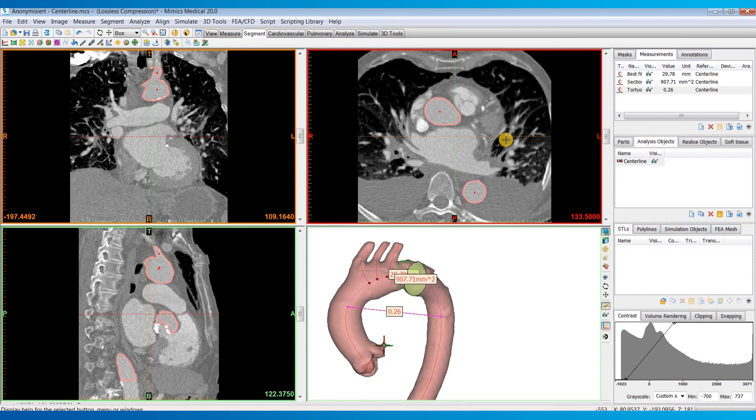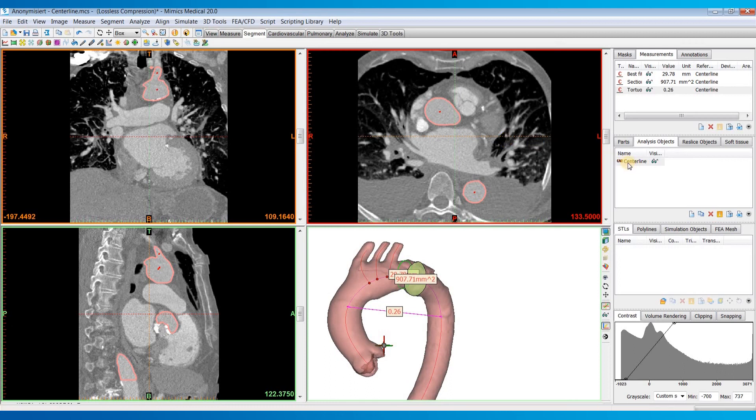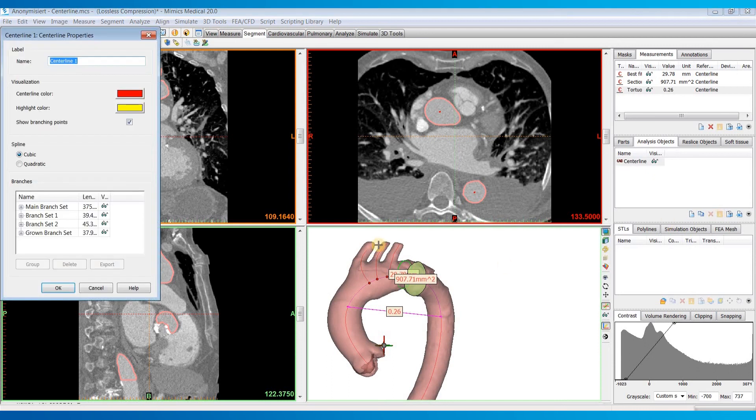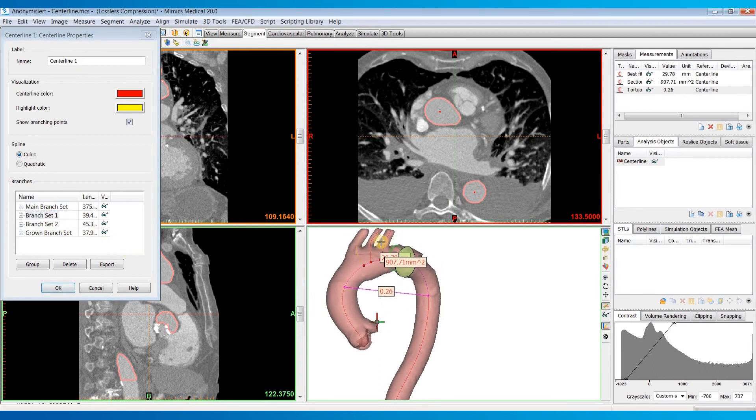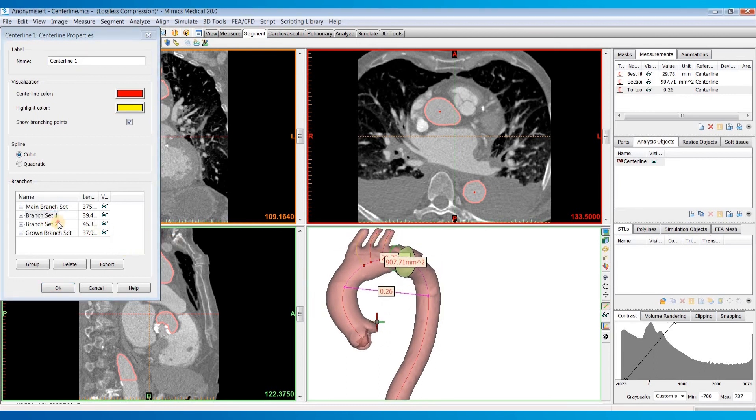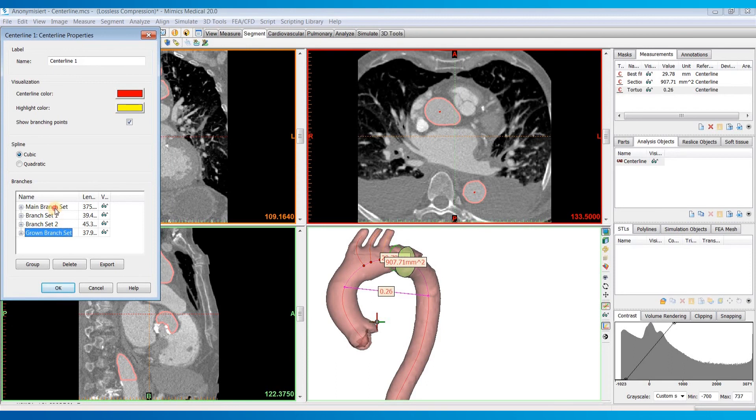Now let's say we want to take a measurement throughout the entire branch of one of these centerlines. A much faster way to do it than manually clicking on each point is to click on your centerline, click on the properties tab. And then we can choose which branch we want. So you can see as I click on these different branches, you can see them get highlighted in the 3D view.